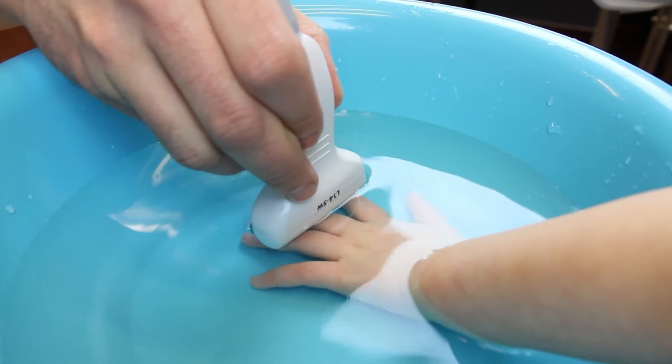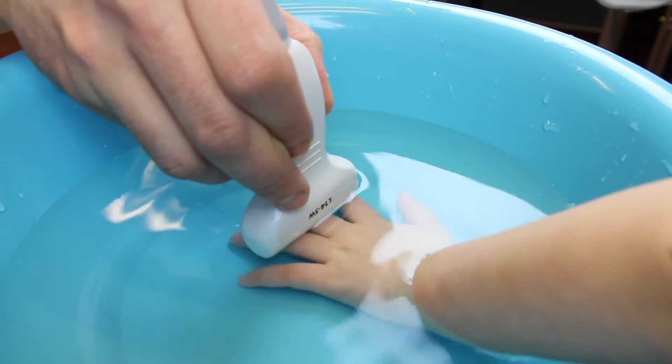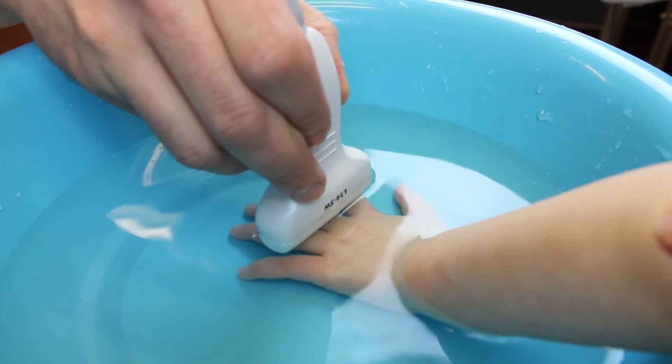The water is a perfect medium for soundwave transmission and gives an excellent image quality. Here's a video of the hand of an older healthy volunteer where you can visualize the fingers in cross-section. You see the water appears as black over the top of the digits.